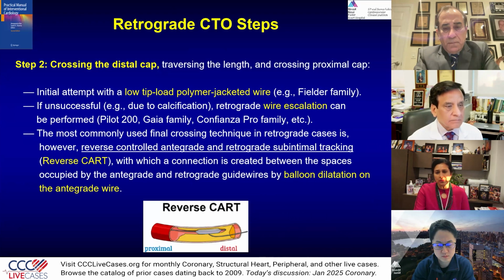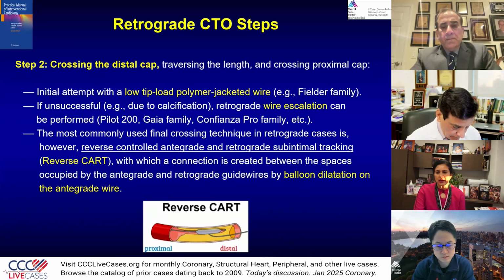So again, same, you start with whatever you're comfortable with. If you want to use Pilot, Gaia family, good. And of course, I like the Miracle. We started with the Miracle, and after that, we used the Confianza Pro.